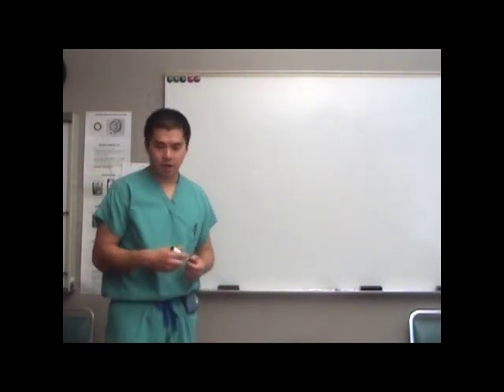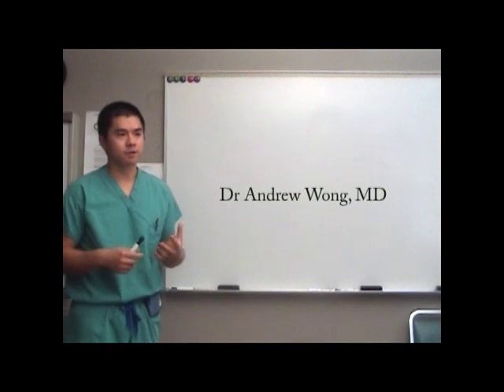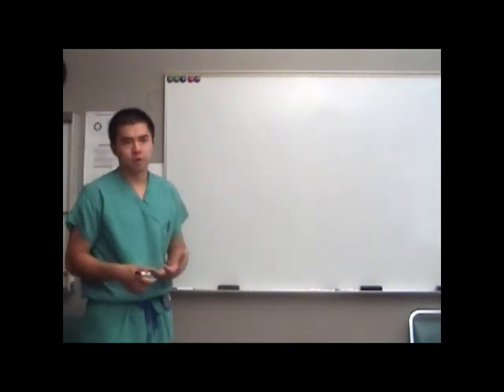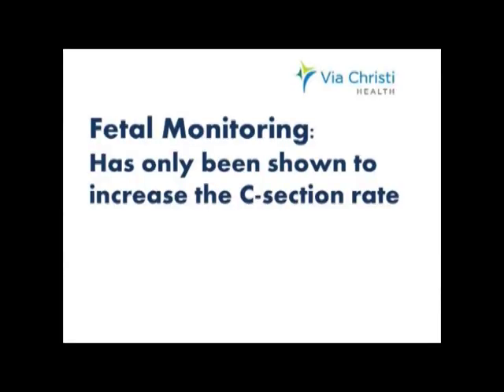So today we're going to talk about continuous fetal monitoring. First off, it's important to know why we do it and what outcomes it changes. What has continuous fetal monitoring been shown to do? It's only been shown to increase the C-section rate.